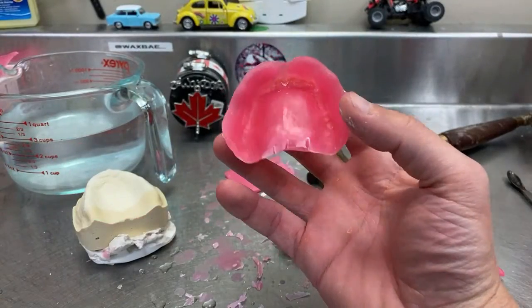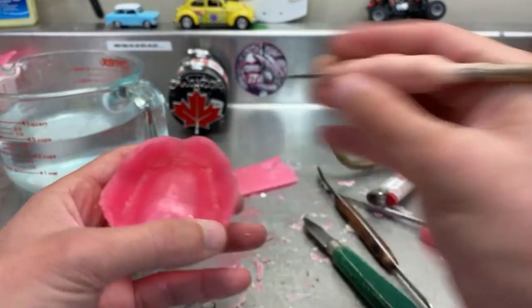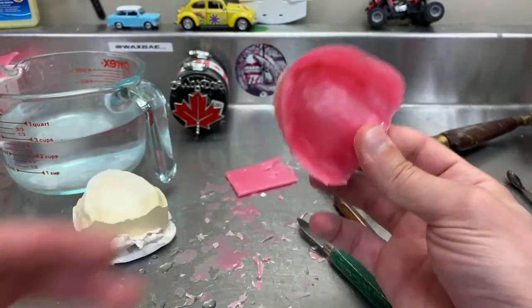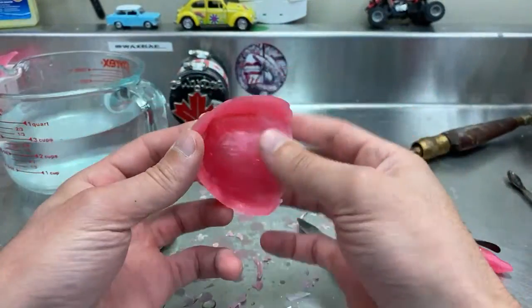And now it came off. See this wax here? I made it thick so it does not distort, and it's actually pretty strong right now. You don't have to worry about it.